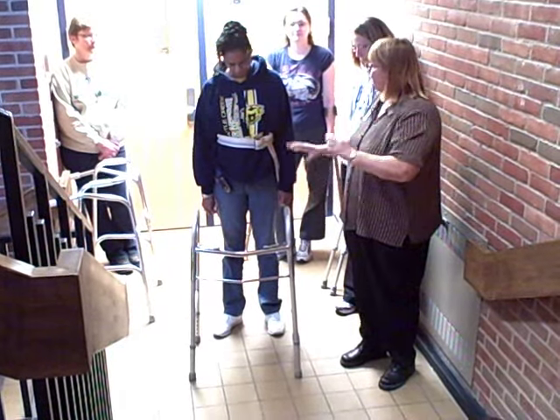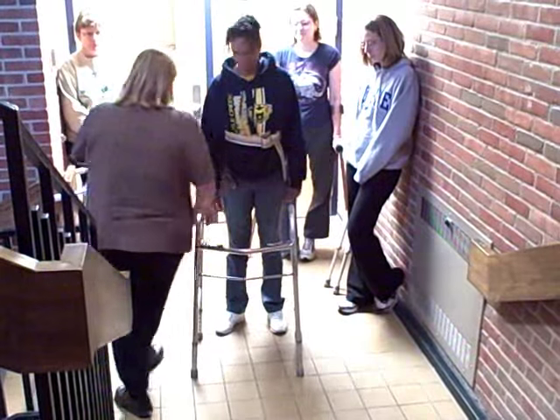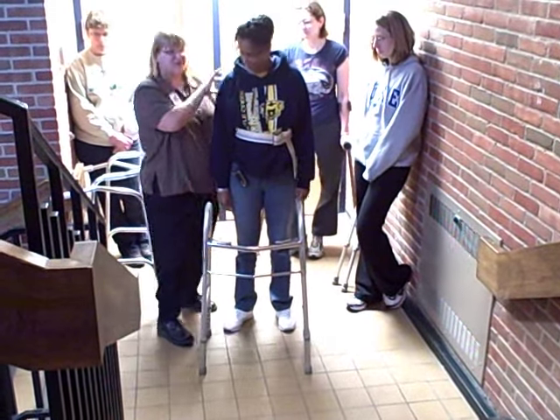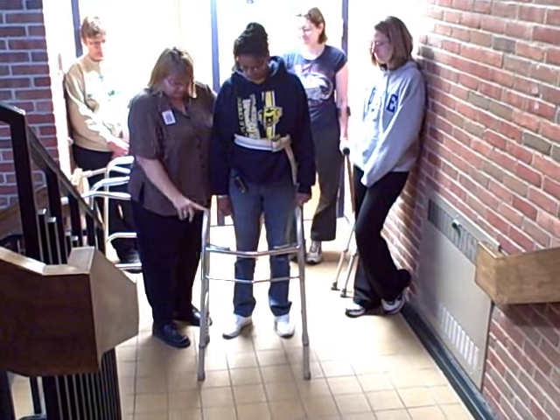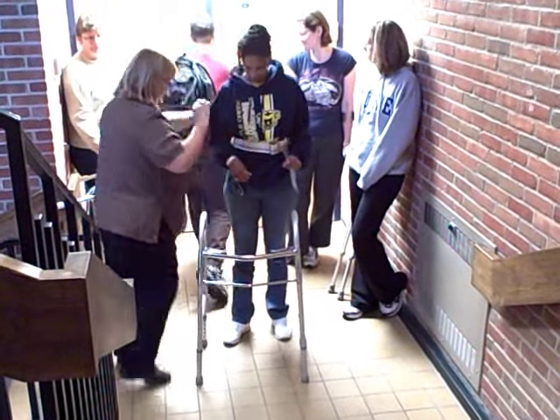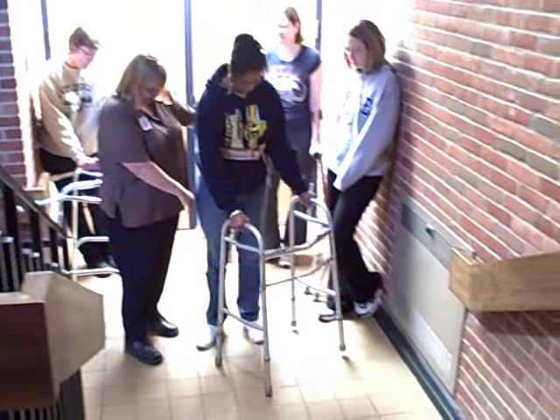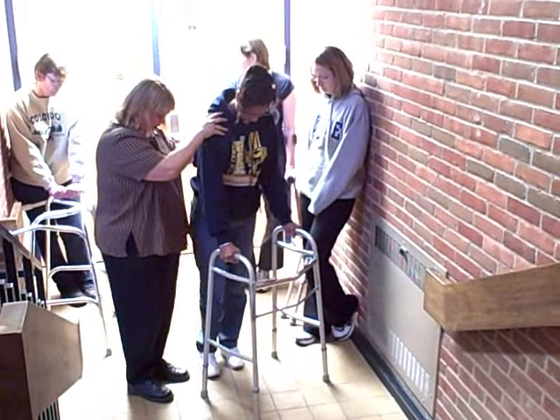I'll talk you through it again, just like I demonstrated for you recently. So I'll get the patient up — she's in standing position. Go ahead and put your hands on the walker, and we're going to walk over toward that side, so we're non-weight bearing on this leg now. Hold that one right up off the ground.